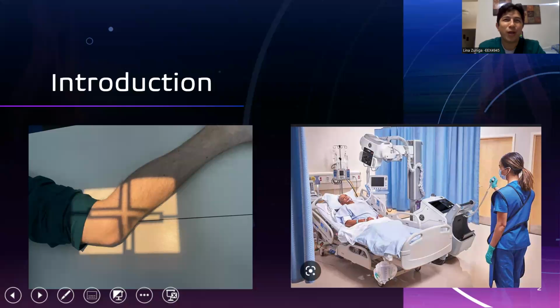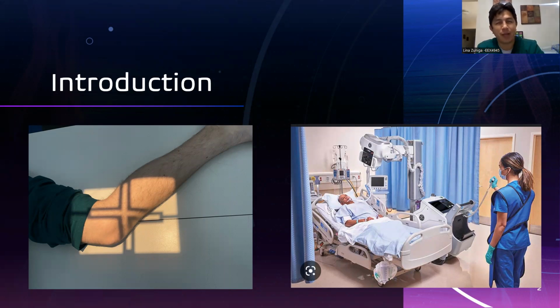If you're going to do a lateral X-ray of the knee, for example, for the most part, they will position themselves, or at most they will do what you request them to do. After all, it's a class that teaches us the positioning, how to position a patient correctly. However, in the field, you will find challenging situations where the patient is physically unable to follow the given instruction.